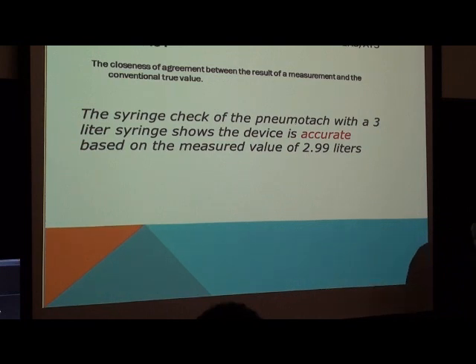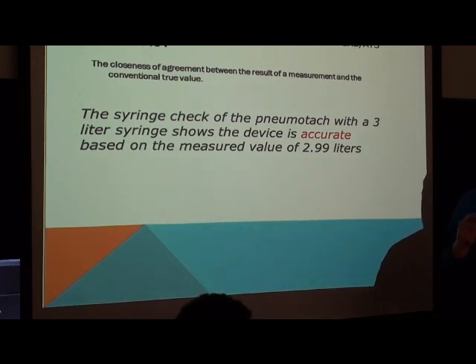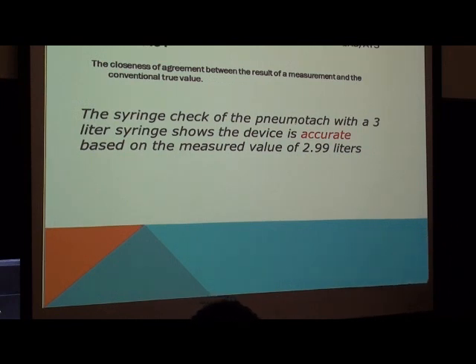This is what we do in the morning. Now it's not quite that simple, as those of you that are calibrating know. We're calibrating both inspiratory and expiratory volumes, and we're doing it over several ranges of flows that simulate what the patient would be doing at the start of the forced vital capacity maneuver, where there are very high flows, and also very low flows at the tail end of the forced exhalation, when the patient's almost empty.